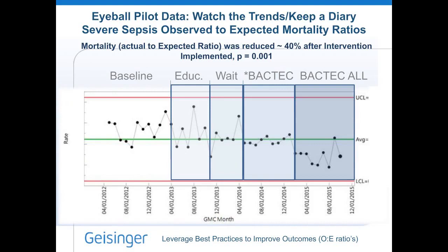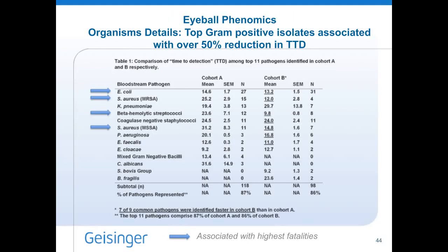After I saw this trend, and you don't need to be a biostatistician to see this trend, all you need to do is have a bar chart and a calendar and bucket your categories. Then you go into each of the buckets, starting with our wait time, when the education was performed and the hardwiring was taking place, which was not statistically different from each other, but looking at the changes in the BACTEC versus this historical information, and then taking those data points and doing statistical comparisons and graphs based on the buckets of information you have from the trend line.